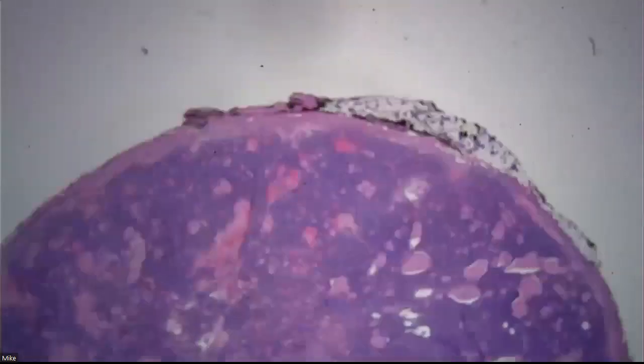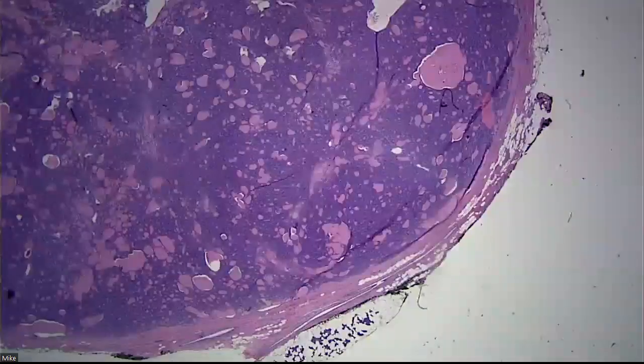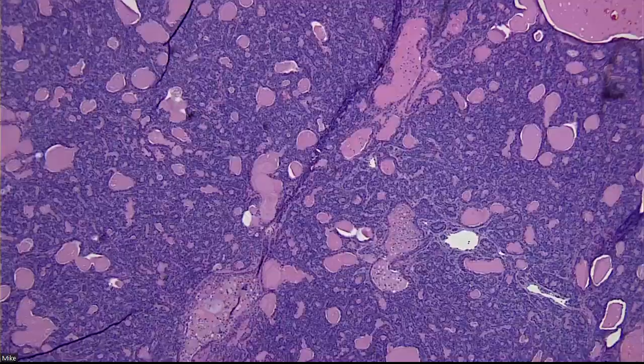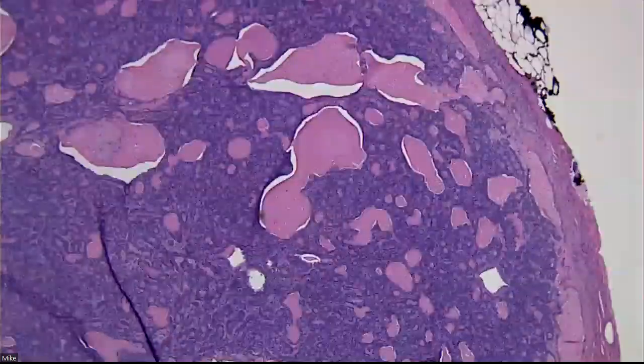It can be a myoepithelioma. It's very cellular. It's very basaloid. It can be basal cell adenoma. So it doesn't really have the infiltrative growth pattern of an adenoid cystic, right? It's extremely circumscribed, and yes, adenoid cystic can be totally tubular, but this doesn't really have the cribriform pattern. Exactly.